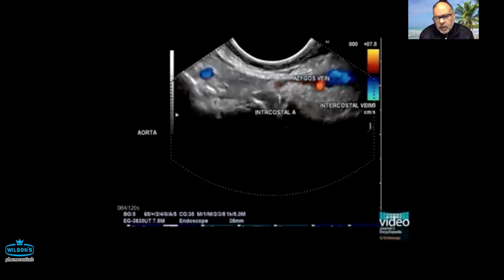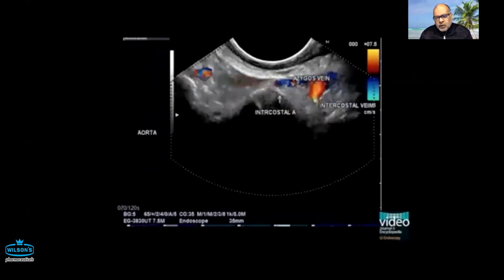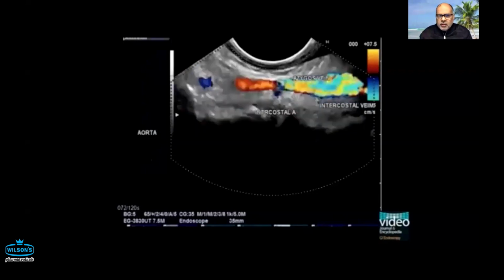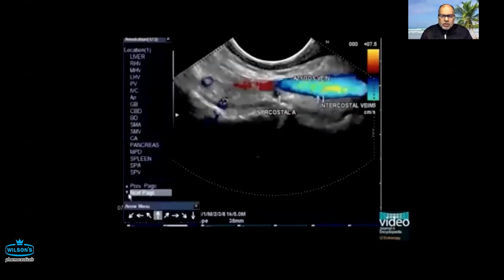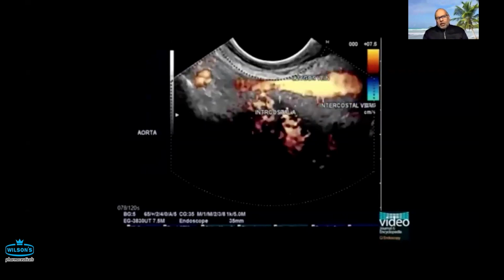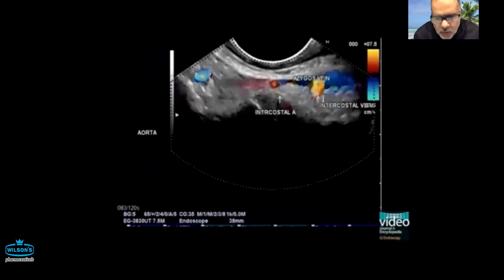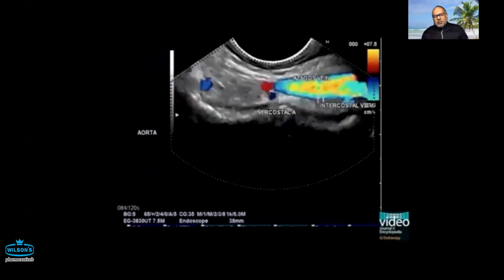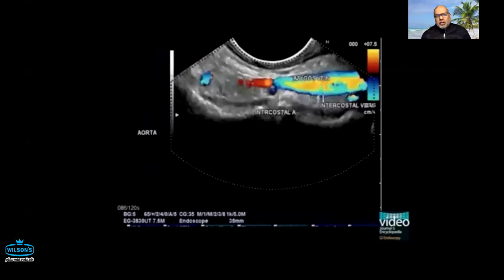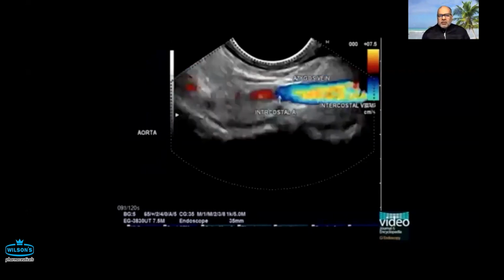This is, you can actually rotate it anticlockwise to the right, or you can rotate it 360 degrees to the opposite side, and you'll have the same result. So whichever is comfortable for you and the scope. Mind you, if you're doing that, it's probably good to move away from the patient a little bit so that your scope is straighter and you have more response from the tip.